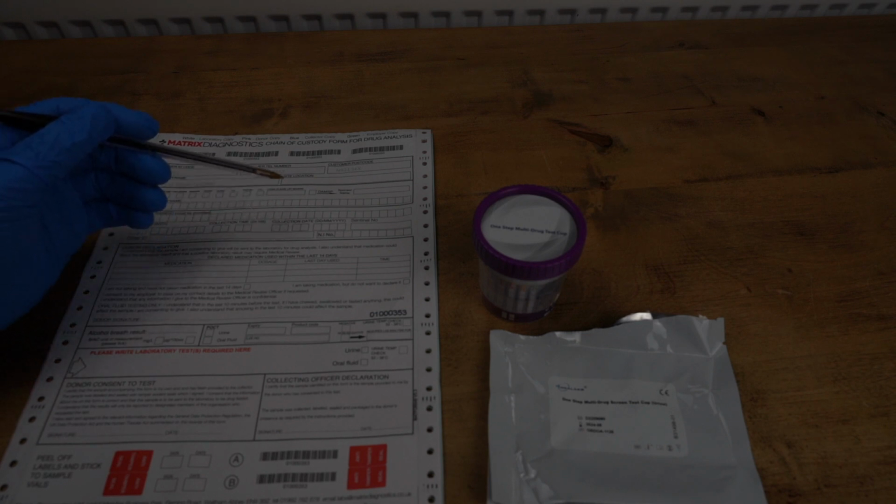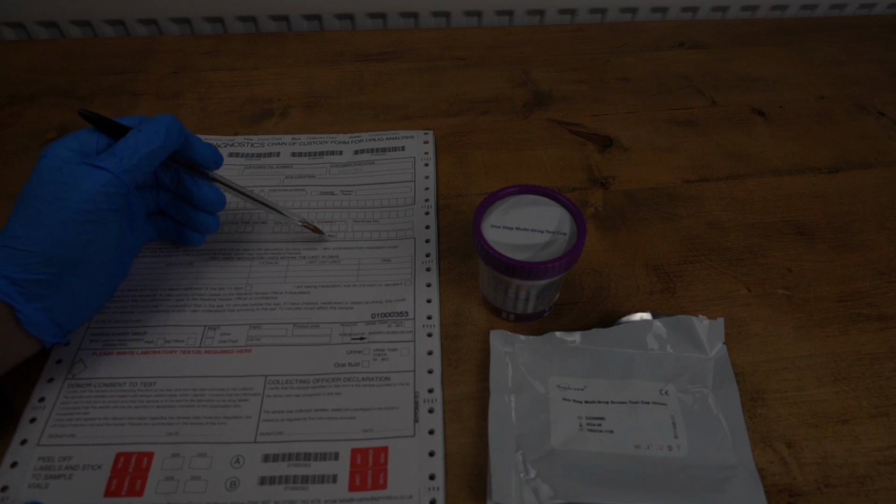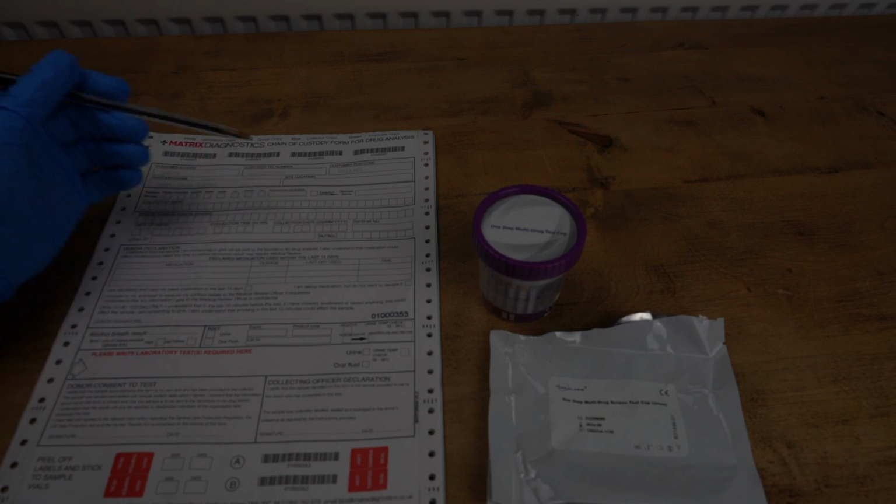You'll only need a sentinel number if your employees work within the rail industry, and they are required to have a sentinel number. And underneath that, if you have it, it's useful to put in the employee's national insurance number.